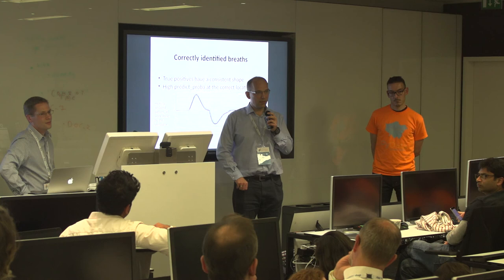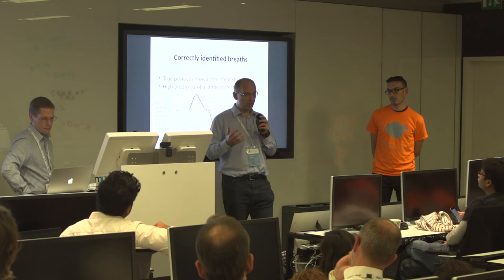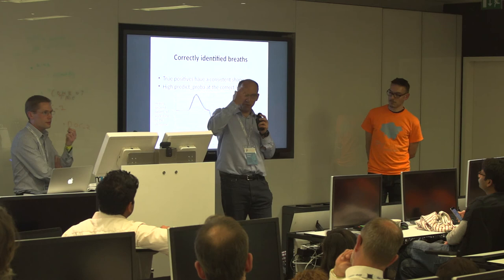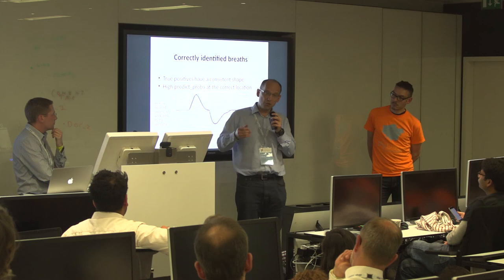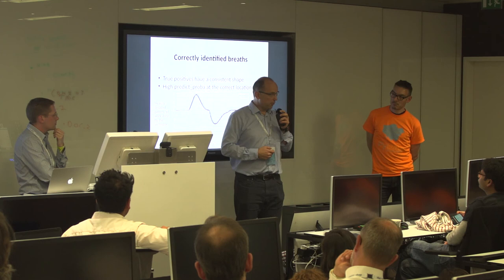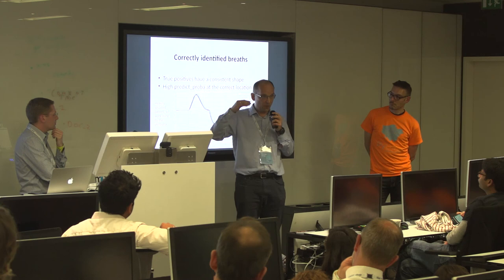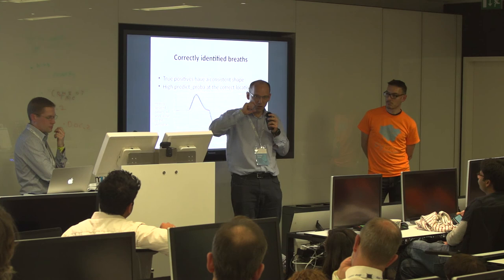Definition-wise, the start of the breath in any individual who has just one pump is very straightforward, because whenever positive flow starts to go in through my mouth or nose into my lung, positive flow is inward flow, that's the start of the breath. You can define the breath differently, for example by the neural or diaphragmatic signal, but that would require access to those signals directly. From a clinical perspective, the best is to define the breath at a level where you can assess it. We have a proximal flow sensor near the endotracheal tube, so we can measure the flow very carefully there and identify the start of the breath.